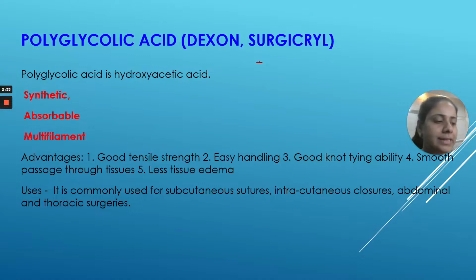Let's jump on to the next section of the video, which is the absorbable suture material. So in absorbable suture material, we will start with the polyglycolic acid.